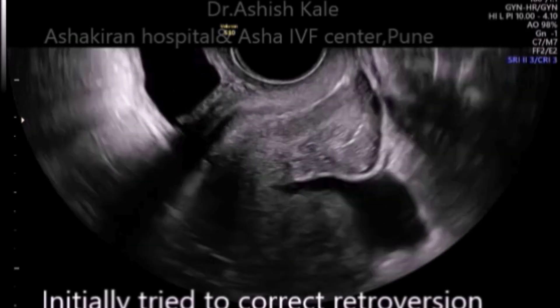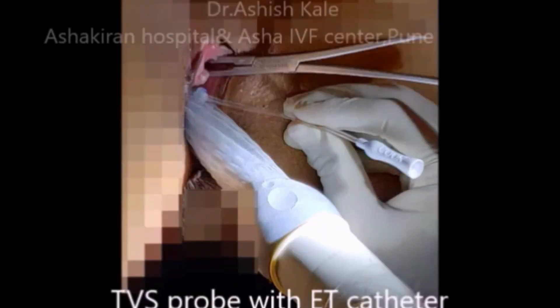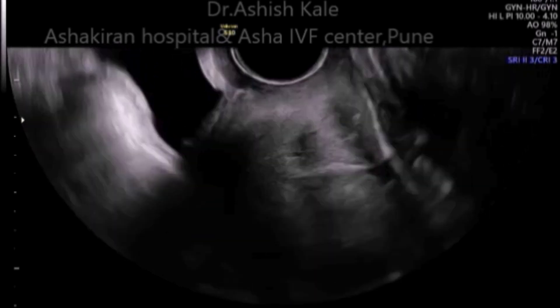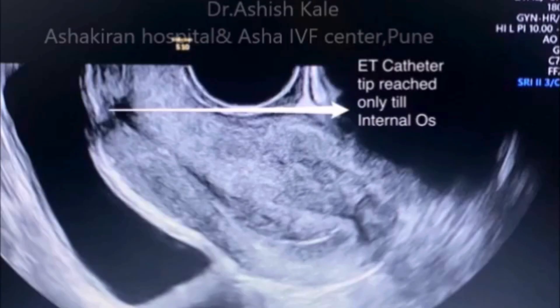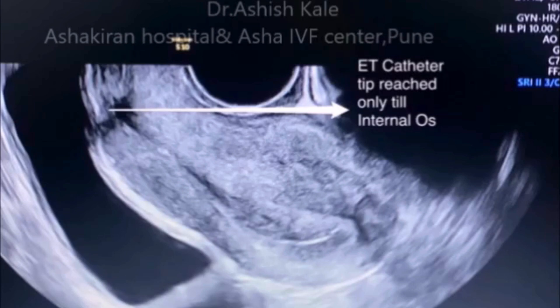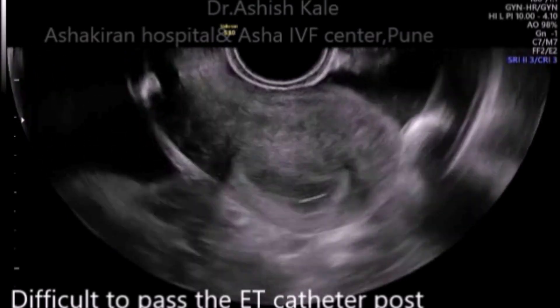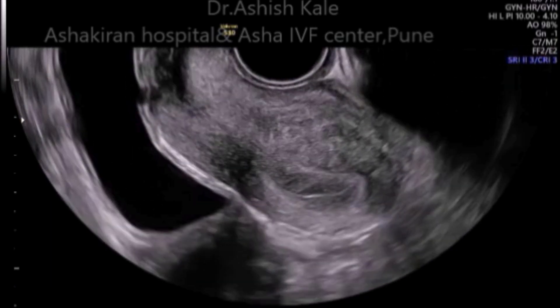This is the view where we are going to try with the catheter under TVS guidance. Because the uterus is acutely retroverted, we won't be able to go through the cervix from the external os. The ET catheter tip only reaches the internal os, and it is very difficult to negotiate from the internal os into the uterine cavity due to the acute retroversion.